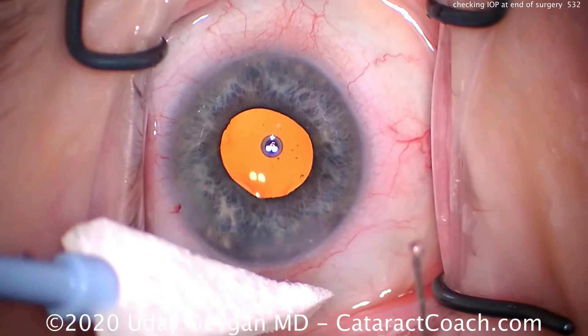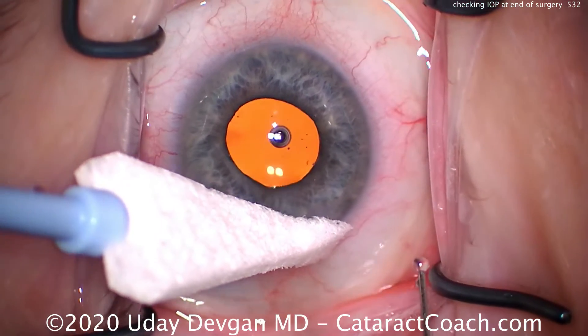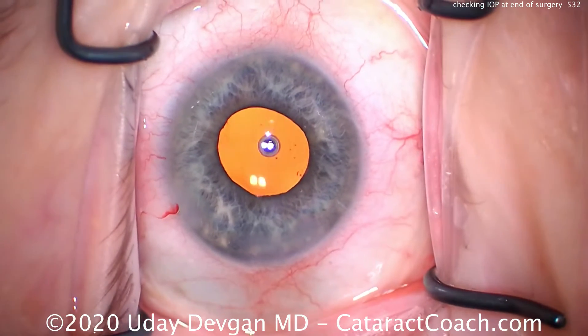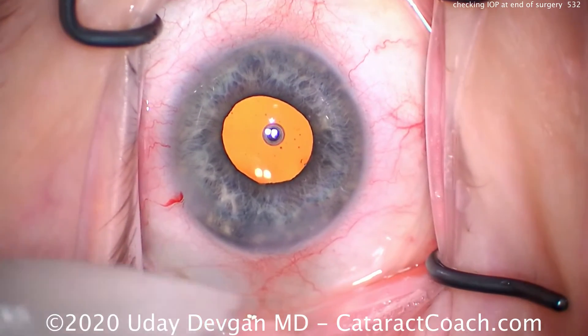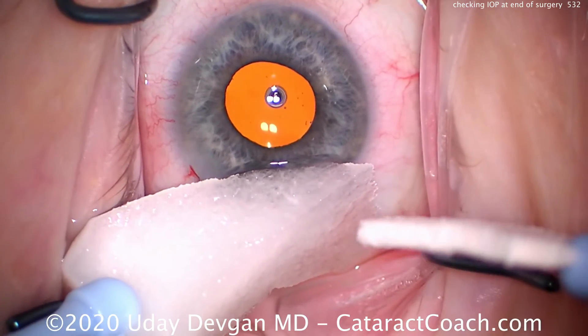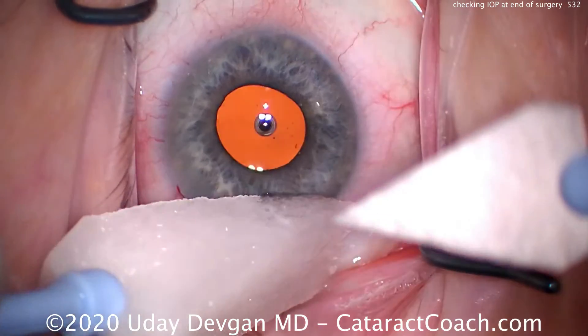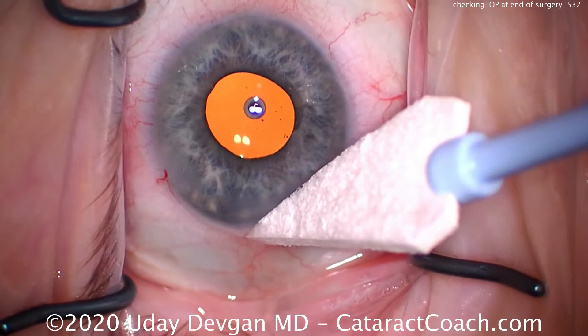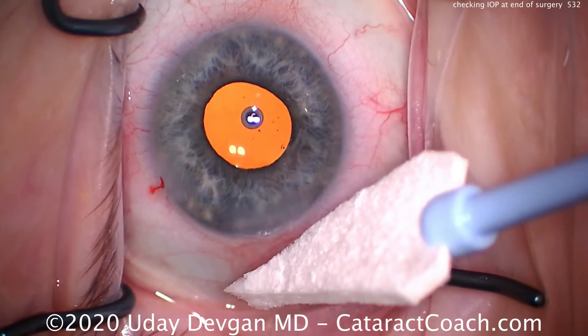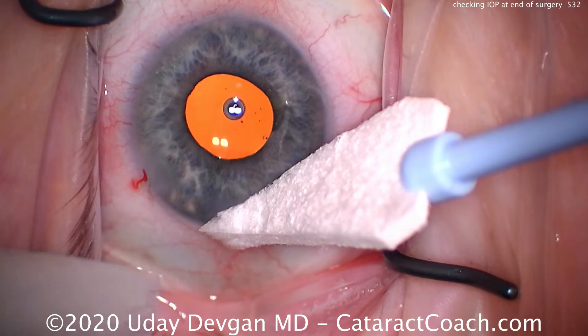With the normal pressure, the incision looks great — much better. Now there's no more leakage. My method is to use this 27-gauge cannula to depress the central cornea, and by how much it gives or how much it moves, I'm able to estimate reasonably accurately the intraocular pressure. It certainly takes time and practice, and you'll get used to it as well.